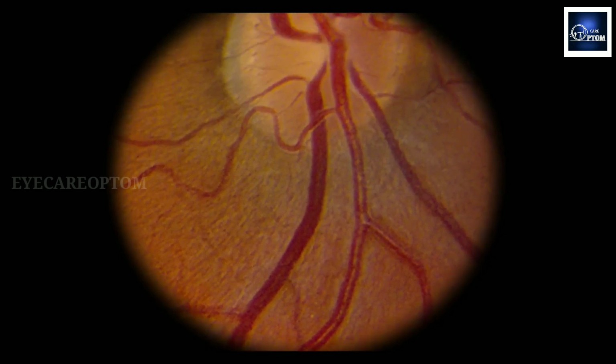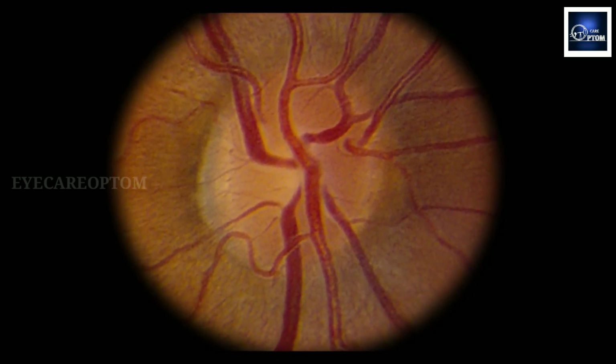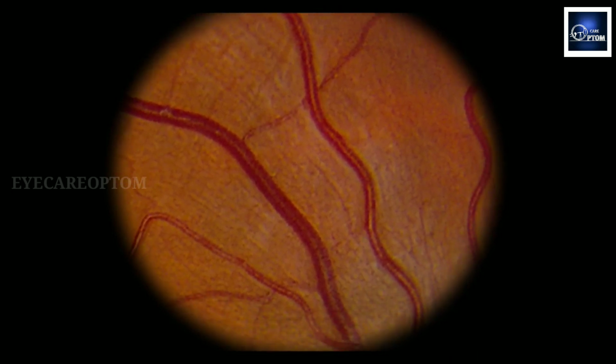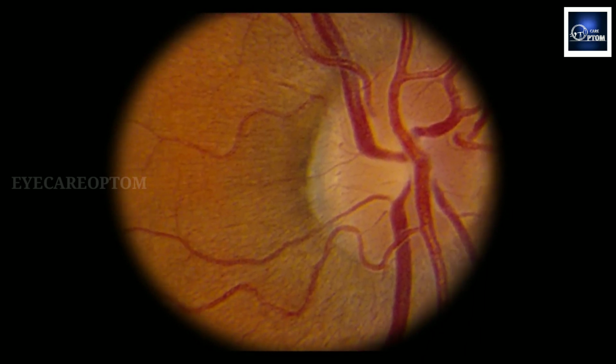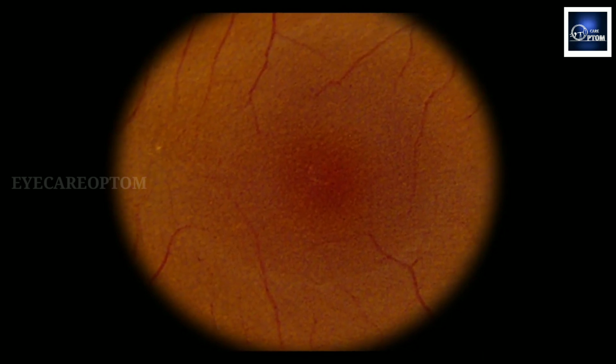After reaching the optic disc, you can fix your location and angle, and you can move your ophthalmoscope slowly to check the surrounding areas. Move temporally to check the macula. You can follow the same steps for your left eye.